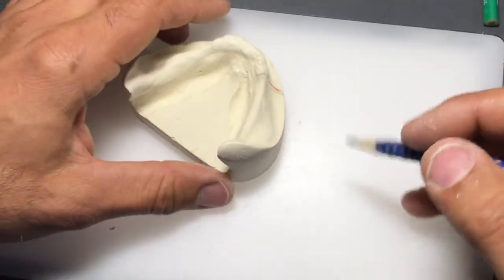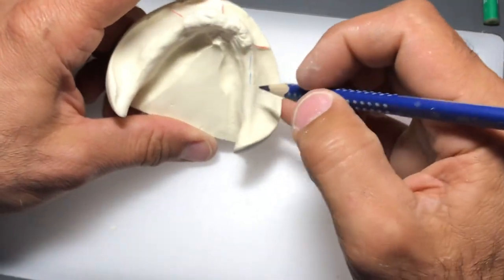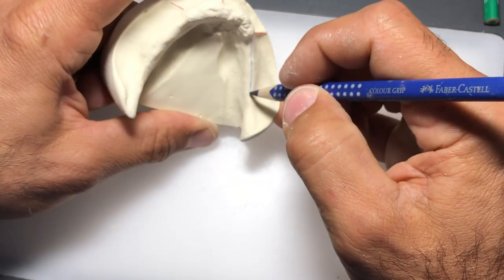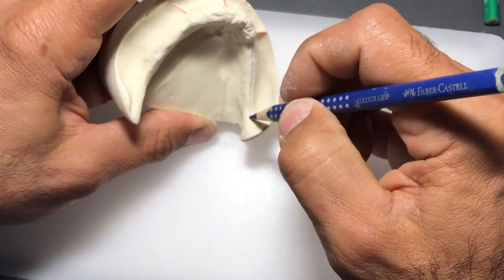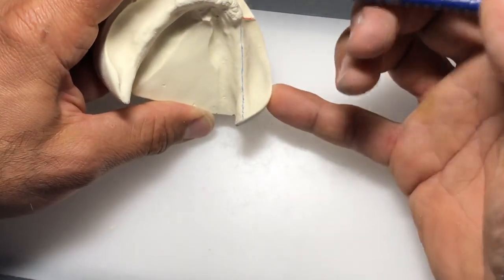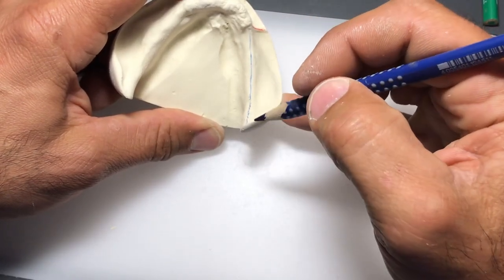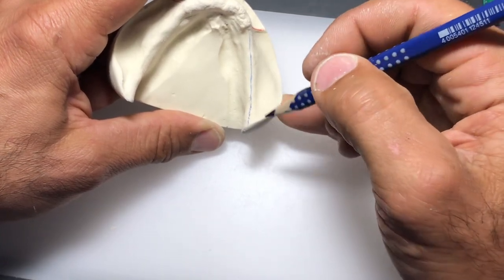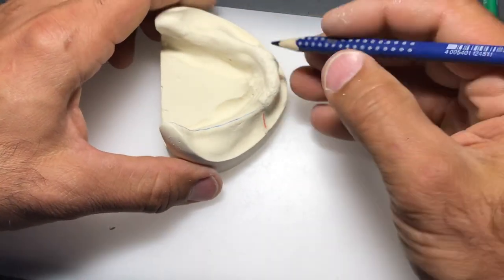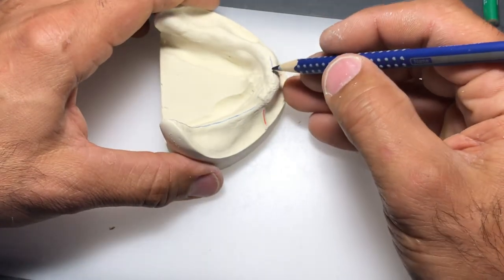If you have any bubbles on your models you can go in with an instrument and pick them out. Minor micro-bubbles don't worry about at this time. Let's identify the crest of the ridge - again this is the highest portion of the residual ridge. I'll remind you to always anchor your hand holding the pencil somewhere on the cast - notice I'm anchoring my pinky on the cast to create an almost hinge-like motion with my right hand, and I'm rotating my cast as I draw.